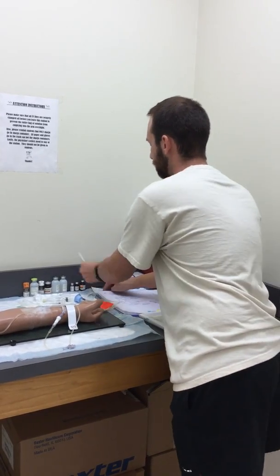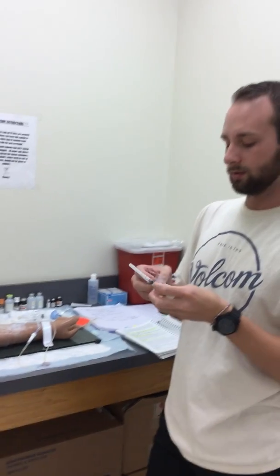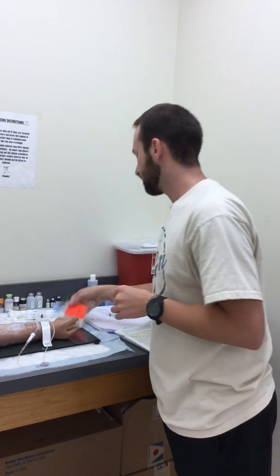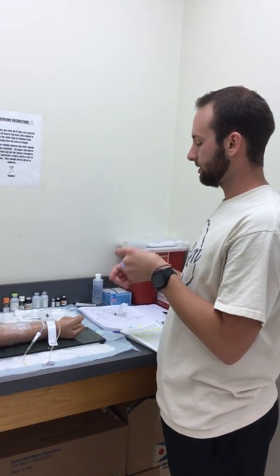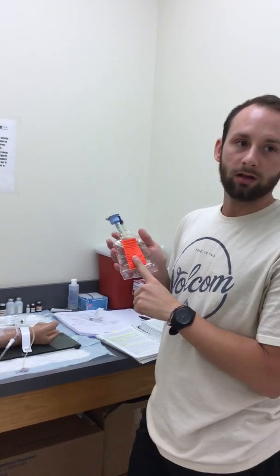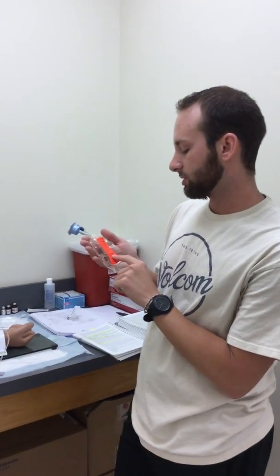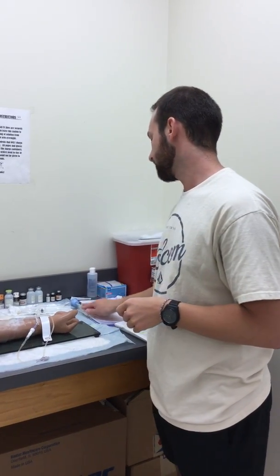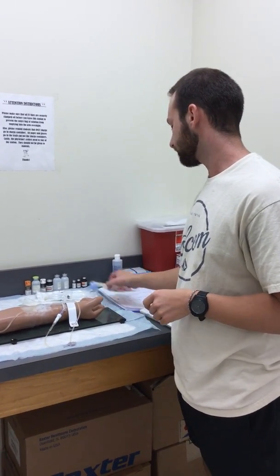Label the medication with the patient's name, the medication, and the dose we're giving. We're going to again compare it to the MAR, make sure it's correct. And we've got our Zantac. We're going to go ahead and mix it, and it's going to be pre-mixed. And we're going to make sure we have our label on it, with the patient's name and the dosage that we're giving. We're going to compare it back to the MAR and make sure that it's correct and accurate.